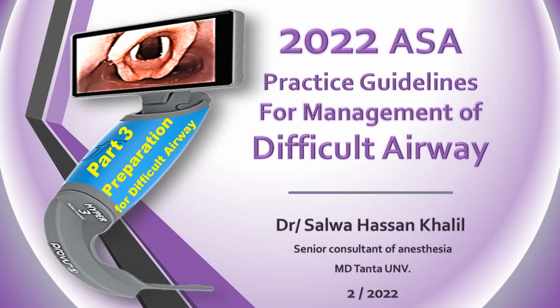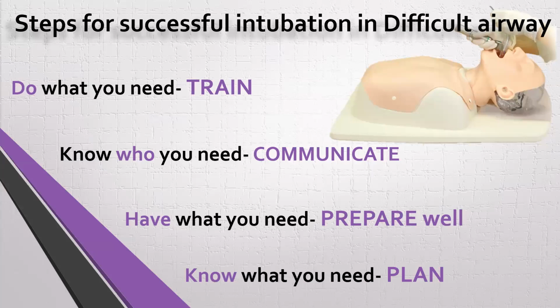We will talk today about part 3, preparation for difficult airway. Steps for successful intubation in difficult airway scenario. In order to improve your intubation skills in difficult airway scenario, you have to do what you need.